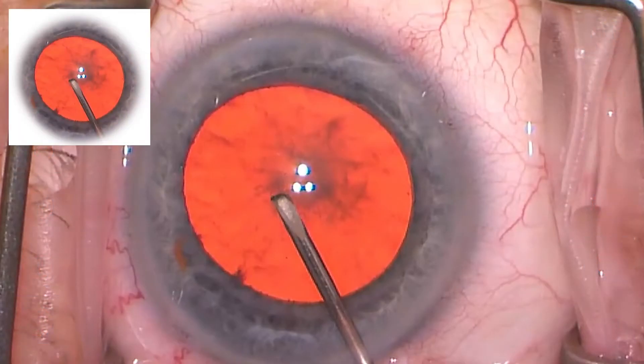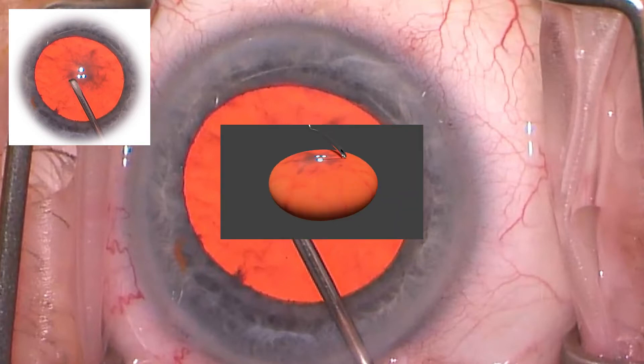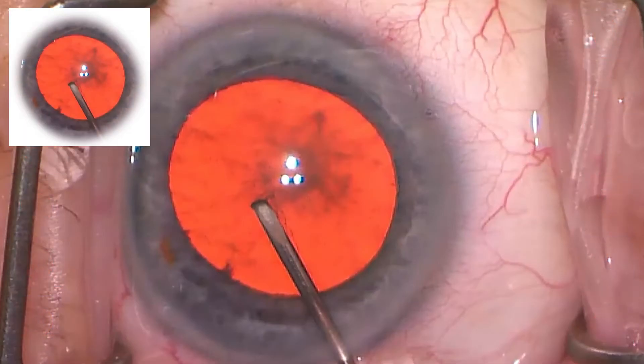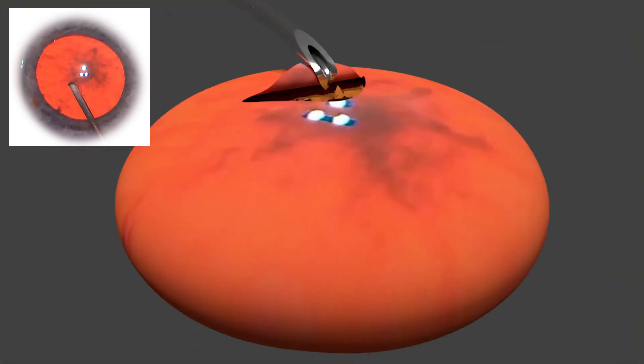Here is station 2 in this rhexis initiation, where the initial incision has been extended into a cut. Here is the 3D view opposite the cystotome, and to this point the rhexis initiation has gone smoothly. This third station is where the surgeon begins to convert the slit into a tear by pulling the cystotome toward the keratotomy. Now the accompanied 3D view as the capsule begins to peel free — by this stage, the process continues to go well.